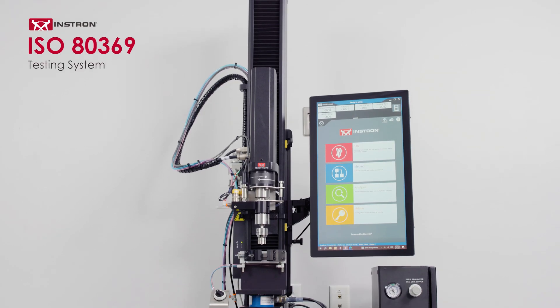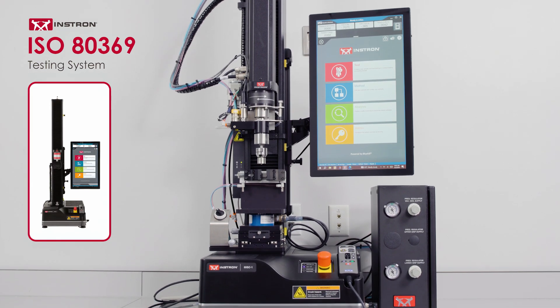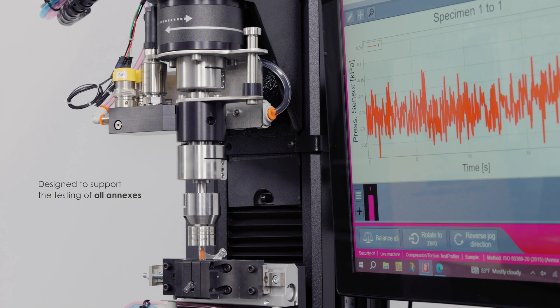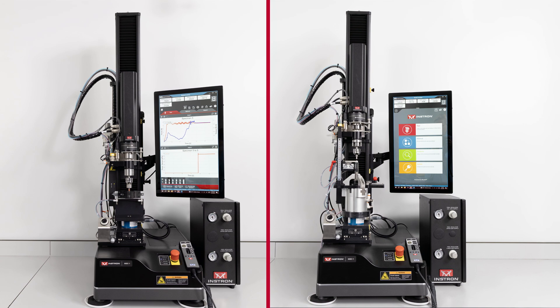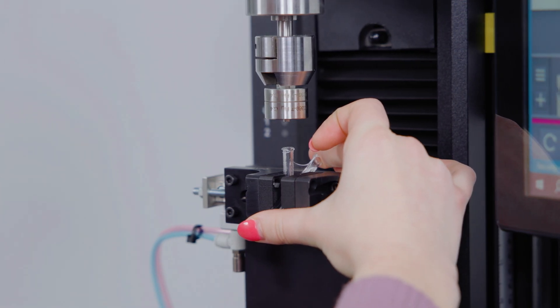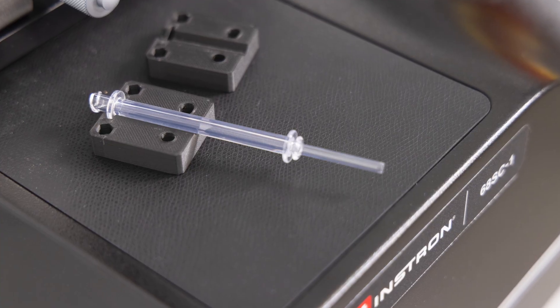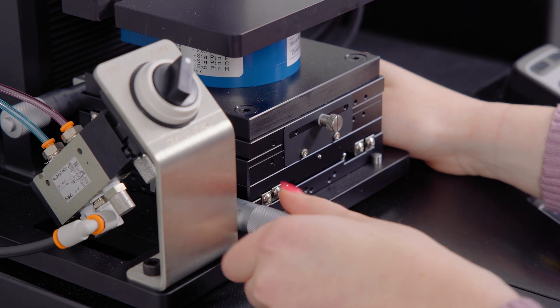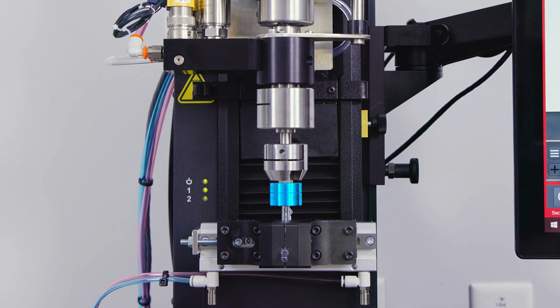The Instron ISO 80369 system is built upon a single-column universal testing machine with biaxial capabilities and is designed to support the testing of all annexes. The device-specific fixturing comes in two main configurations. The first is a highly flexible pneumatic grip with interchangeable faces designed to match various hub geometries. The entire grip assembly is mounted on a manual XY assembly to ensure consistent alignment between the device under test and reference connector.